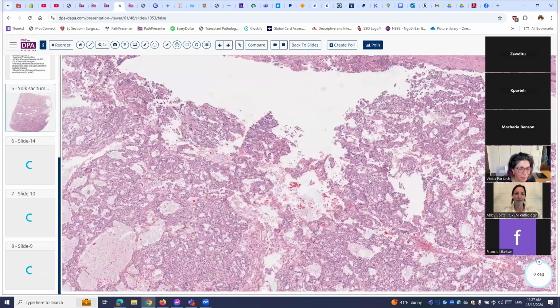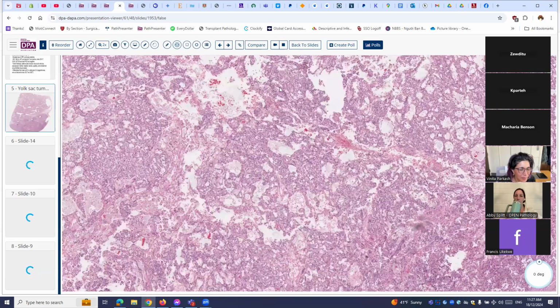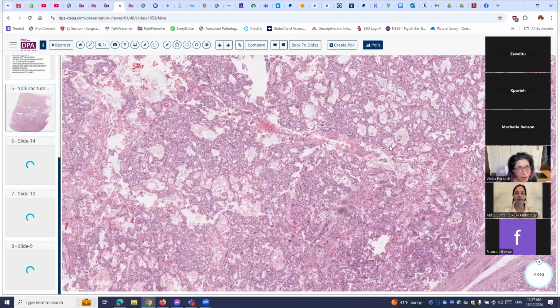What immunohistochemistry would you do on this, assuming you didn't have the AFP in the serum? Glypican is positive. I guess it depends on what the differential diagnosis is. If embryonal carcinoma was the differential, then CD30 should be negative in yolk sac, positive in embryonal carcinoma. Glypican, CDX2 can also be positive in yolk sac tumor. CD117, PLAP. I don't know. Am I missing what you are thinking about?